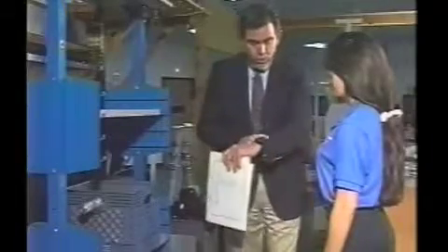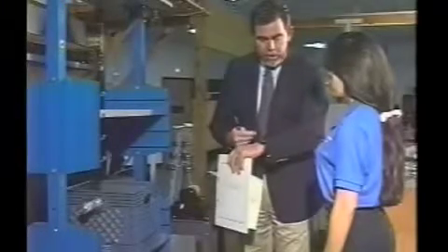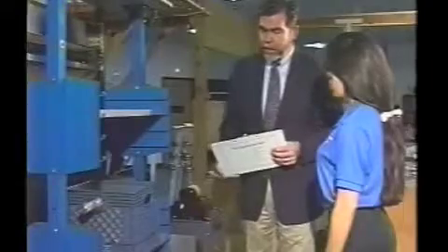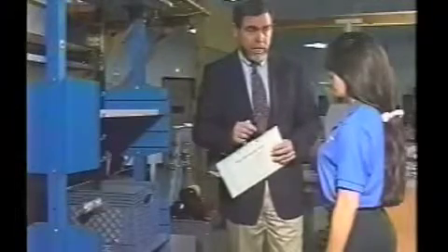I'm also going to record your heart rate by looking at my little monitor here. You're wearing a heart rate transmitter, and that's going to tell me how much work your heart is doing for you to be able to do that lift. I'm going to ask you then if you can do that lift on a safe and dependable basis 8 to 12 times a day.